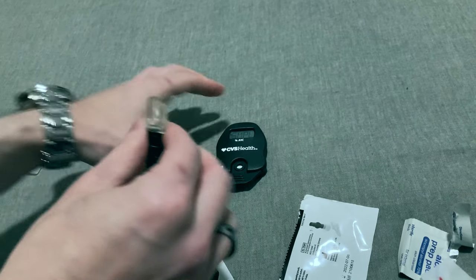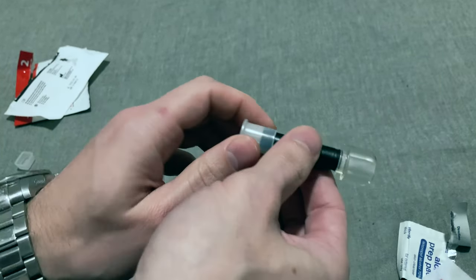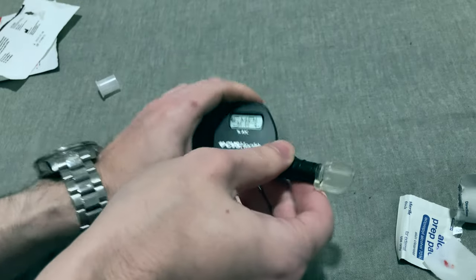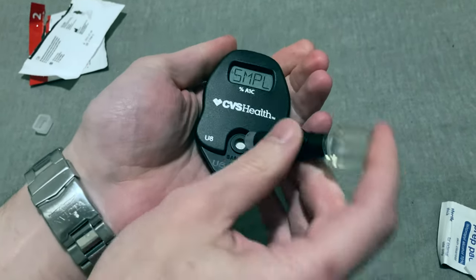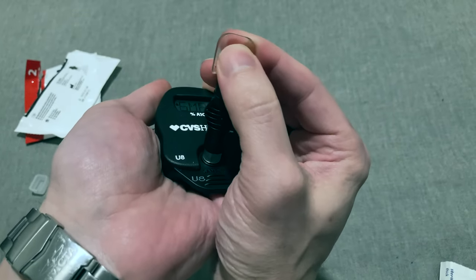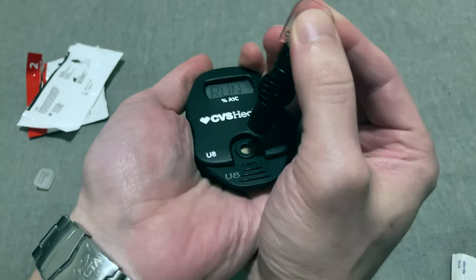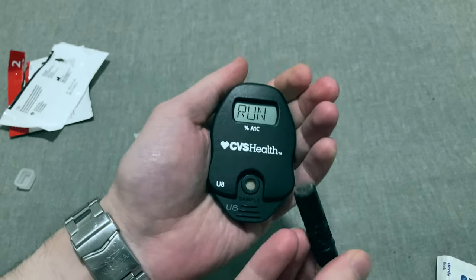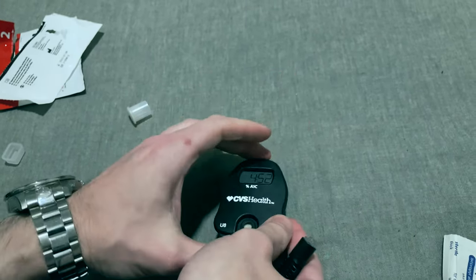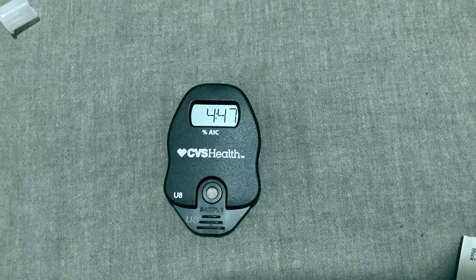All right, so to actually use the unit, you take the cap off the shaker assembly and you're presented with this. And you take it and you're going to apply the sample like that to the unit and then press down. Like this. And then you're going to see that it says it's running. Make sure it's flat. And you want to leave that flat on the table like that. And what it's going to do is it's going to run the test.